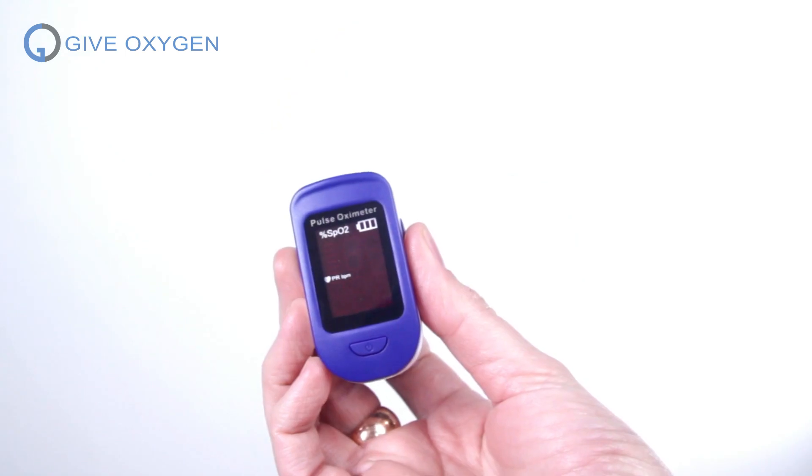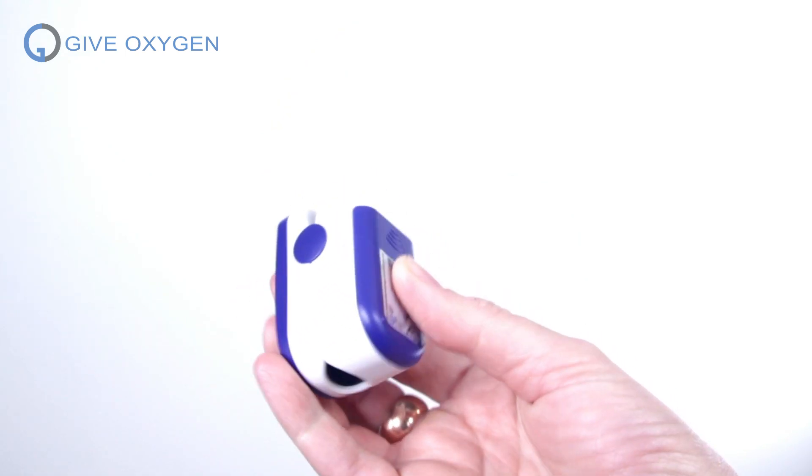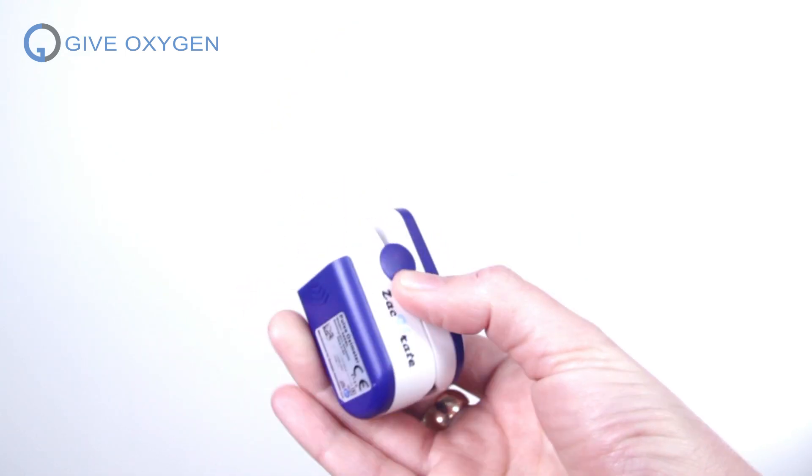For me personally, I wanted something to help measure my own health in case I got sick, to give the doctors more information if I needed to call them. So here's how these devices work — they measure your heart rate and the oxygen concentration in your blood.